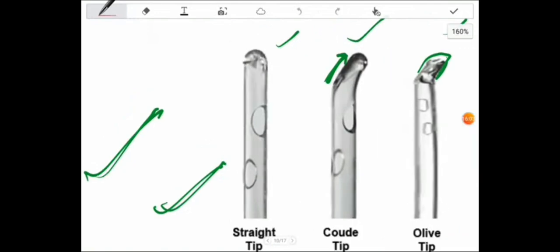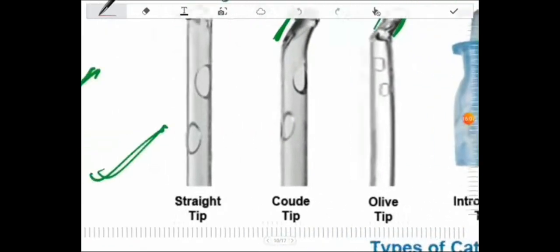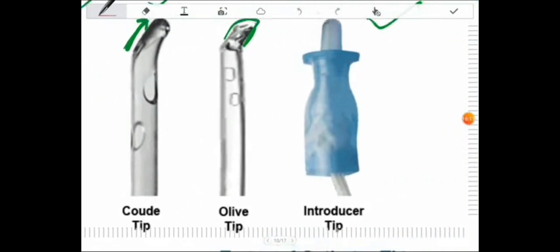So next we'll be talking about the tips. So let's jump into that. Okay, so there are these tips available. One is straight tip, then coude tip, olive tip, and introducer tip.